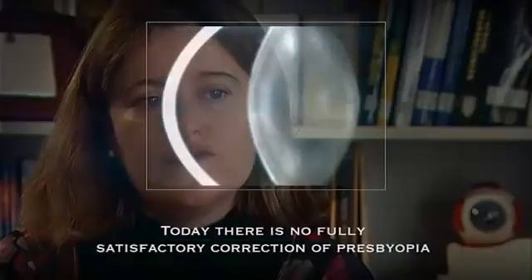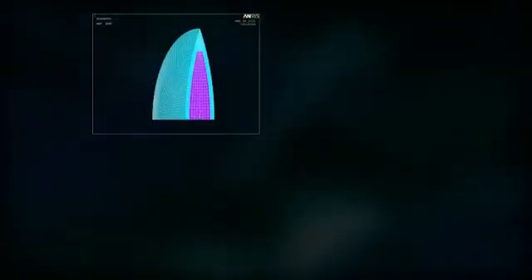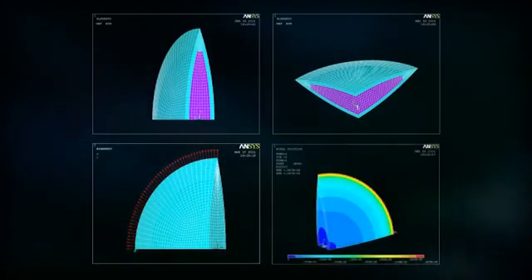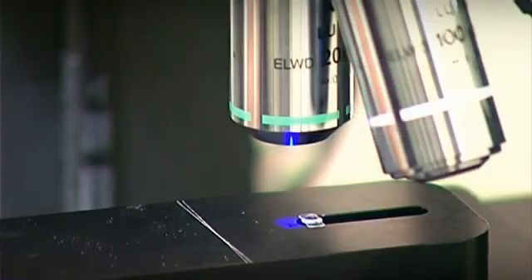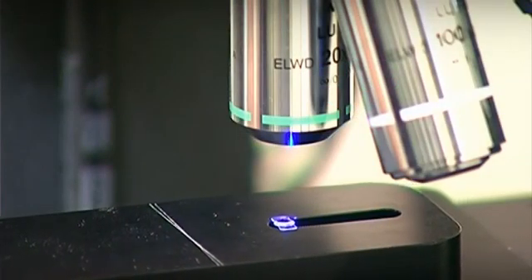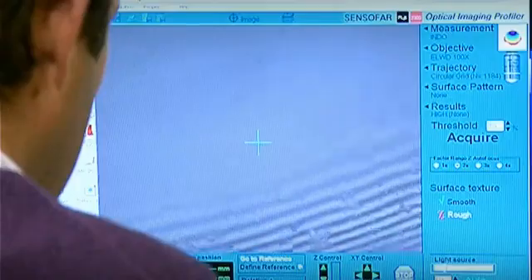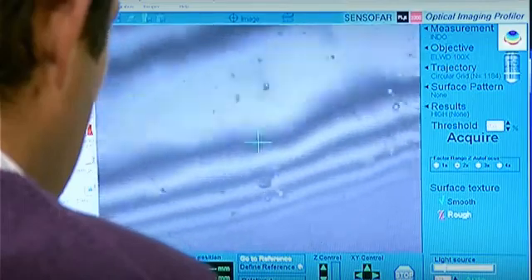Presbyopia could be cured if we can replace the crystalline lens that has no longer the ability to accommodate with an intraocular lens that will have this ability. So these would be sophisticated lenses, unlike the current lenses that are either monofocal or multifocal, and they have to rely on the rest of the accommodative plant working, and particularly they have to be flexible and sophisticated enough to really mimic the young crystalline lens in the eye.